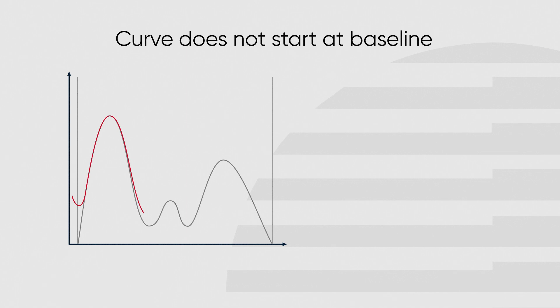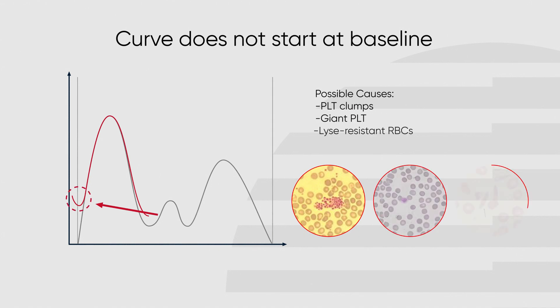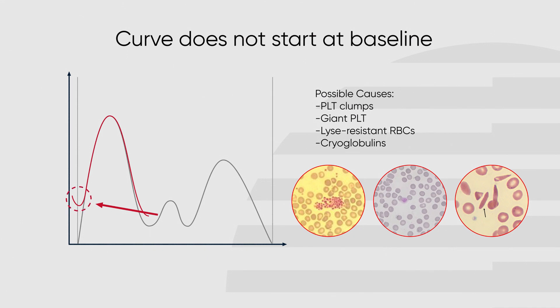An abnormal high at the low discriminator could have several possible causes, such as platelet clumps, giant platelets, lysis-resistant red blood cells, or cryoglobulins. The reason is that the analyzer is unable to differentiate between these cells, fragments, and complexes, as they are very similar in size and the populations therefore merge.